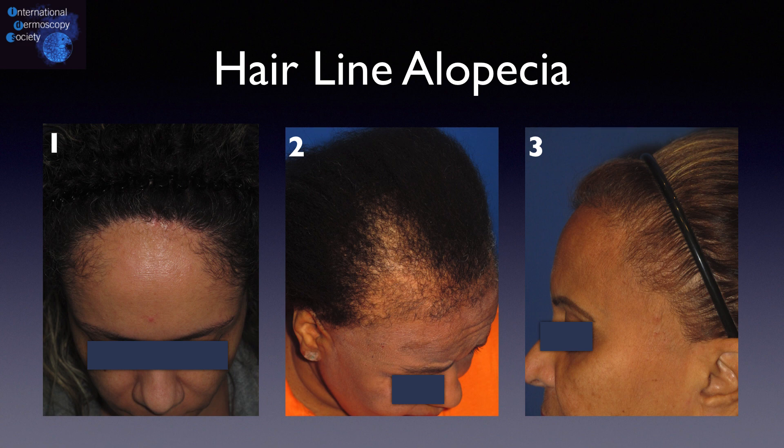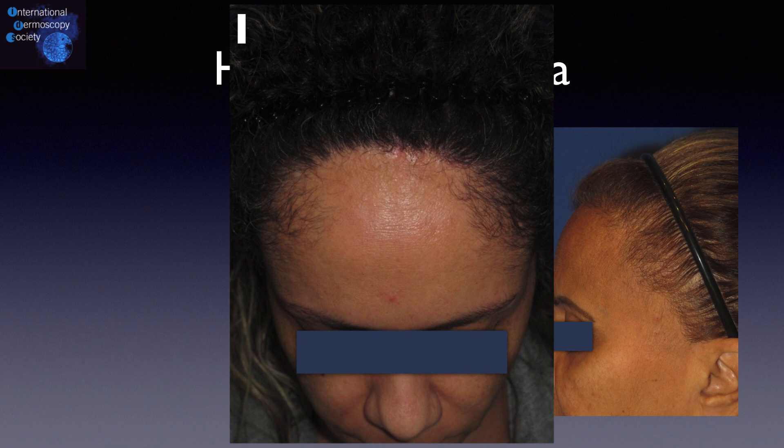Now we will see how tricoscopy can help us diagnose each case. In the first case, we can see hair loss in the frontal area and no eyebrow involvement. The main tricoscopy sign in this case is the absence of vellus hairs, normally seen in this area.